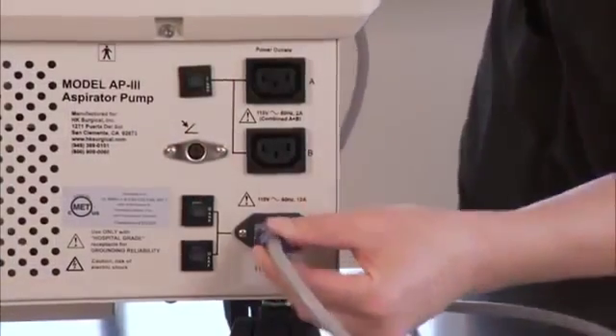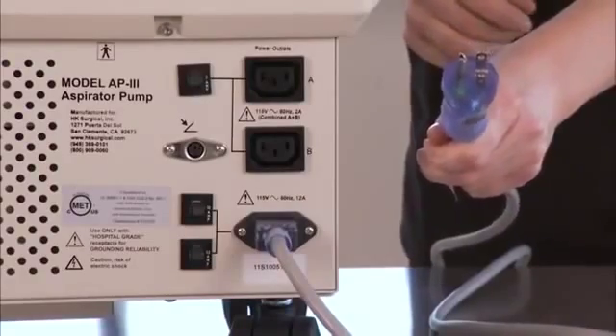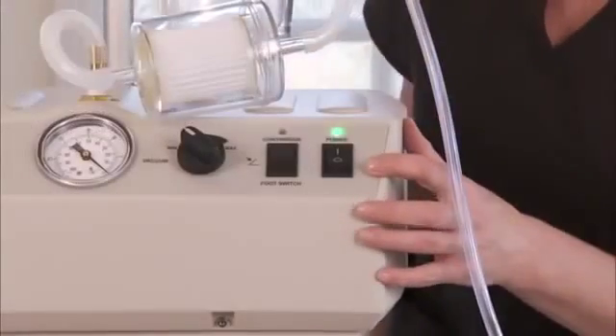Make sure that the unit is plugged in. Make sure that the unit is plugged into the correct power source. Make sure that the main power switch is in the correct position.